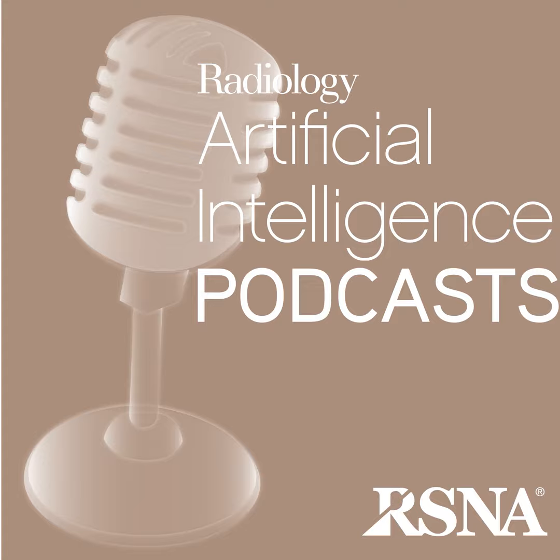Case in point is, for example, Subtle Medical, what they're trying to do out of California, where they talk about this virtual upgrade, right, where you can take a 1.5T image from an MR and make it look like a 3T image. And also, we're seeing already companies like GE are implementing deep learning based iterative reconstruction into CT scanners, to produce further low dose imaging. And all of this leads to cheaper machines or faster scans, or cheaper machines and faster scans, which can eventually lead to greater utilization of equipment in the developing world from a global health perspective. So I think one aspect is surely the scanning and maximizing utilization and maximizing machine lifetime using AI-based technologies.